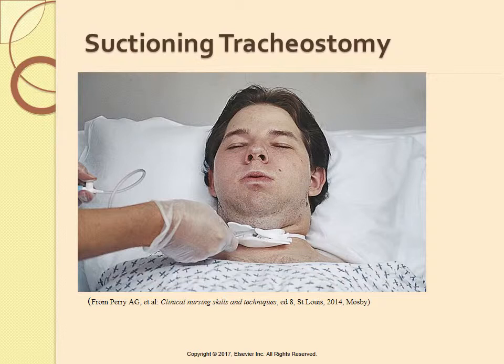Then finally, you'll auscultate to assess changes in lung sounds. Record the time, amount, and character of secretions in response to the suctioning.